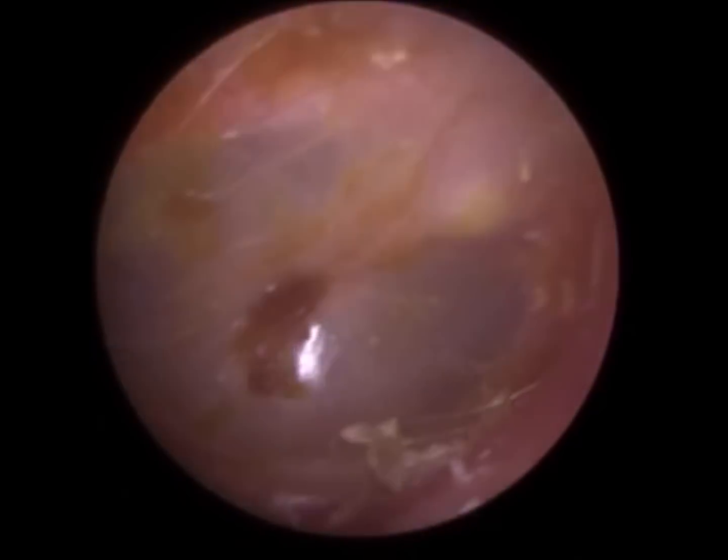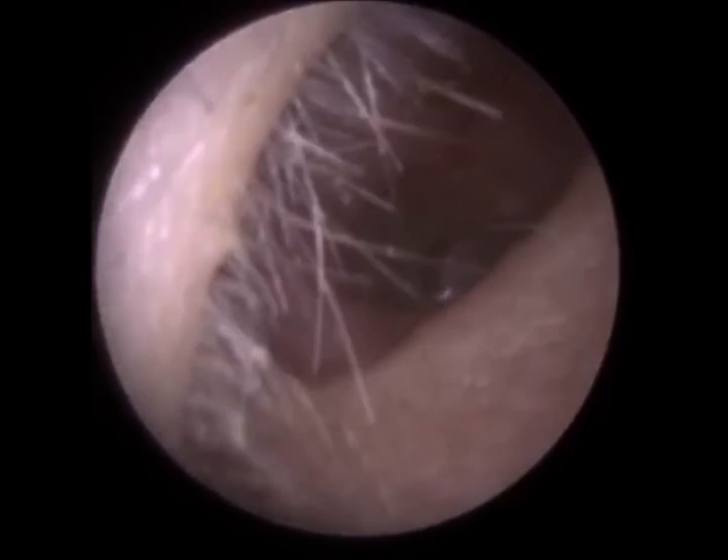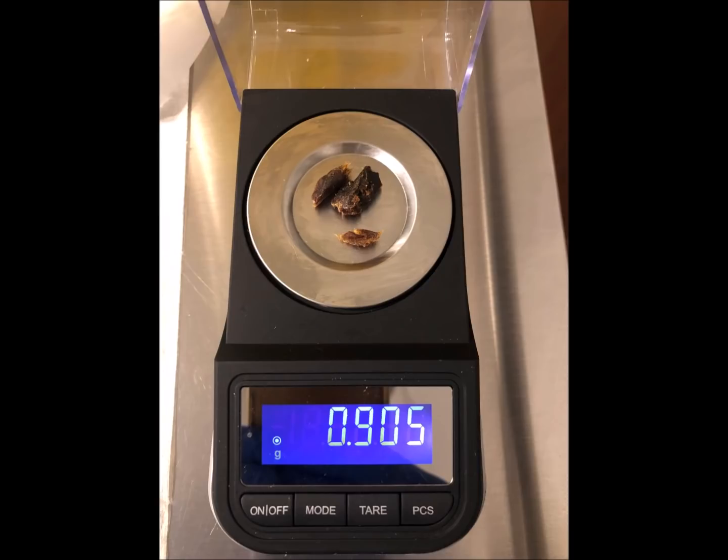And again, just like the left side, there's a bit of residual wax stuck on the eardrum because it was extending almost all the way. There's all the wax weighing in at 0.9 of a gram.